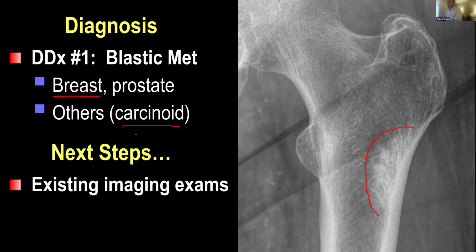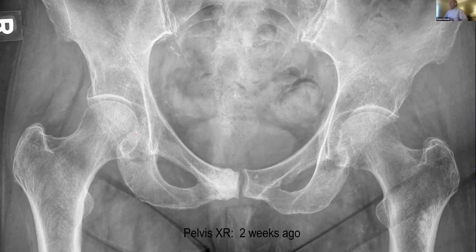Well, radiologists don't have that many friends, unfortunately. And we often say a radiologist's best friend is an old exam. So the cheapest and most efficient thing is to look for any existing imaging exam before jumping to getting another exam like an MRI or asking for a follow-up exam in 3 months and have the patient worry.